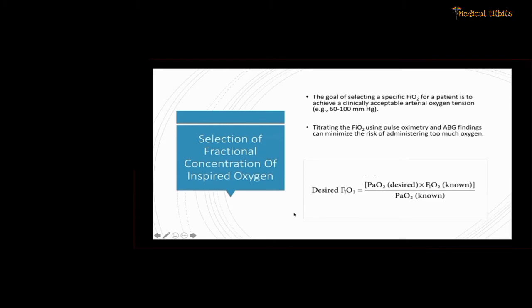Okay, so your idea is to reduce the FiO2 as much as possible, but definitely during your airway manipulation and disconnections, you make sure you give additional FiO2, especially when you are doing procedures like endotracheal tube suctioning.